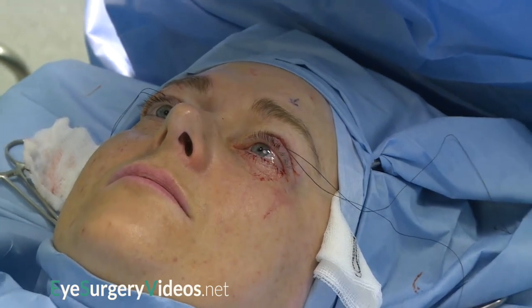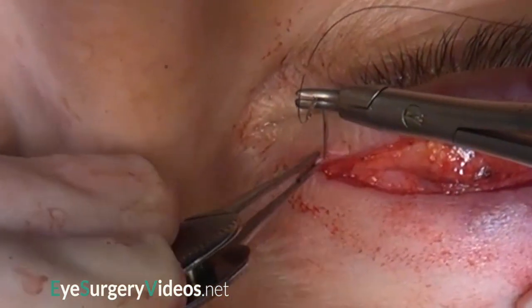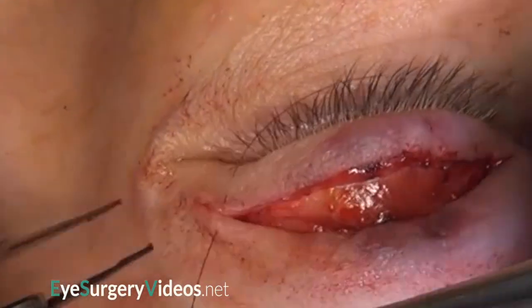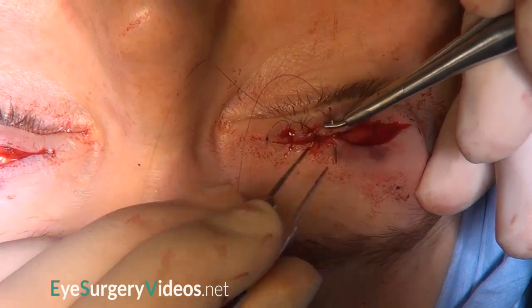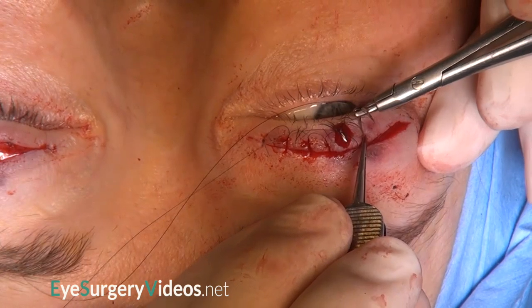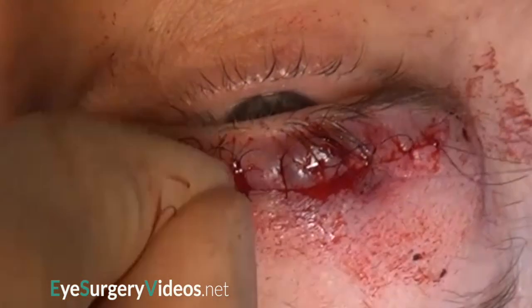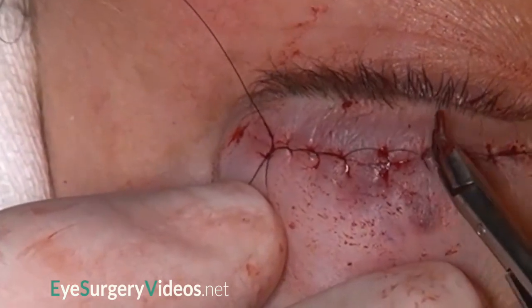The desired lid height and contour have now been achieved. The skin is closed with 6-0 continuous locking nylon sutures. Lid lowering surgery tends to raise the skin crease, as the skin crease is primarily formed by insertion of the now recessed aponeurosis. Various techniques have been described to introduce a lower skin crease, such as suturing skin and orbicularis to the underlying tarsal plate, or interposing the pre-apo fat pad. Here, tension is introduced into the locking suture, causing the skin and muscle to be pulled back against the convex surface of the tarsal plate.